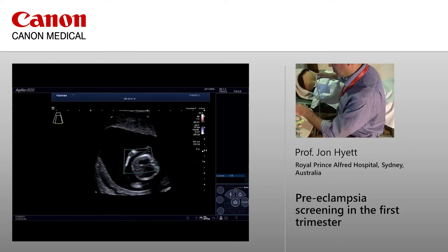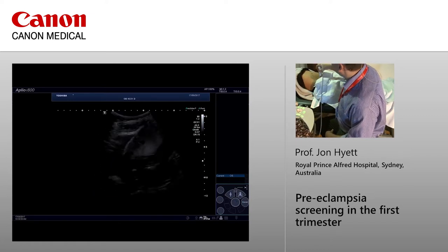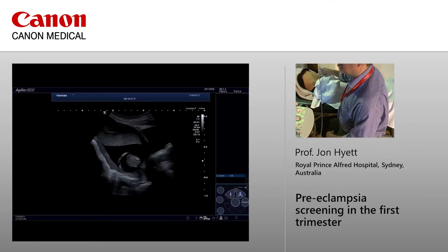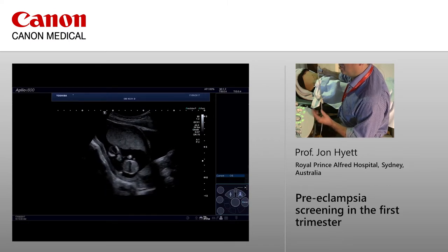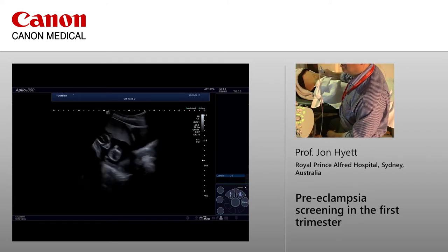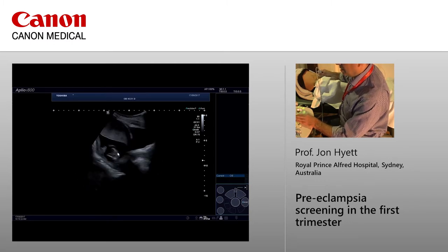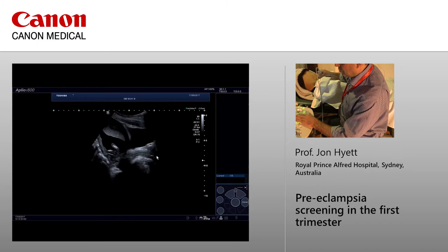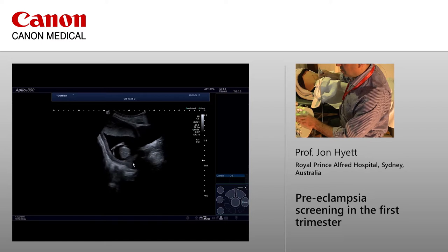What we might do is just whiz off and do our uterine artery Doppler for a moment. So, you okay? You still comfortable? So the first thing that I've done is take a more panoramic view, just to make sure that I'm localizing anatomy properly. You can see here that we've got the bladder on the right-hand side of the screen. You've got the uterus coming around. This is the placenta at the top. I've got our little fetus here. And then you can see where the vagina is coming through. And then this is the level of the cervix in this area here.